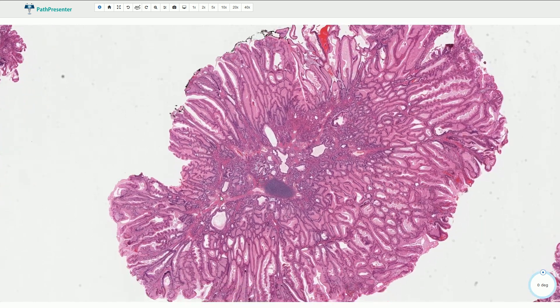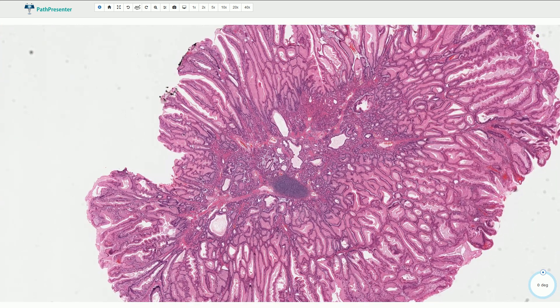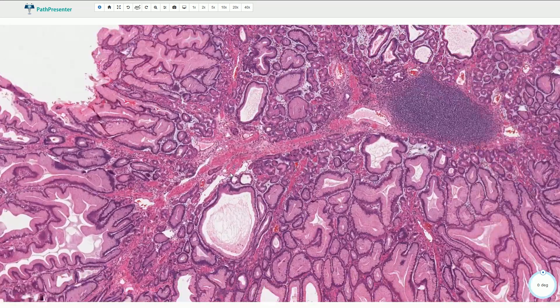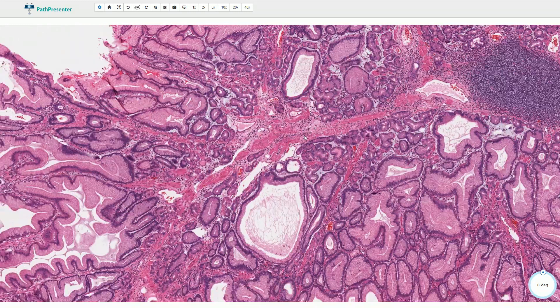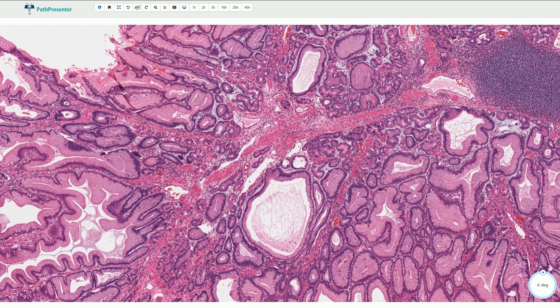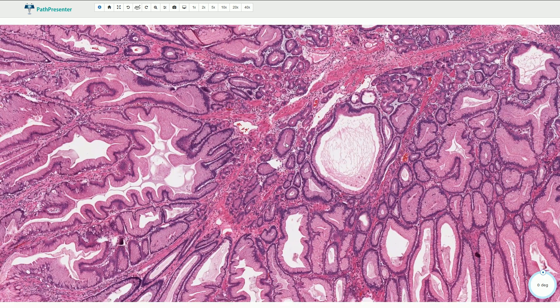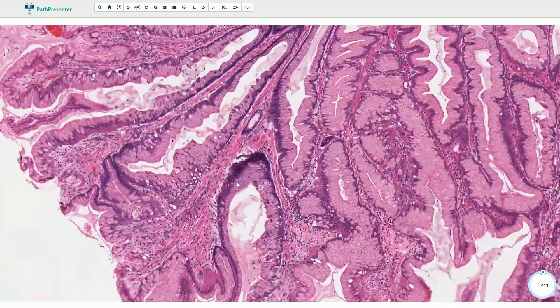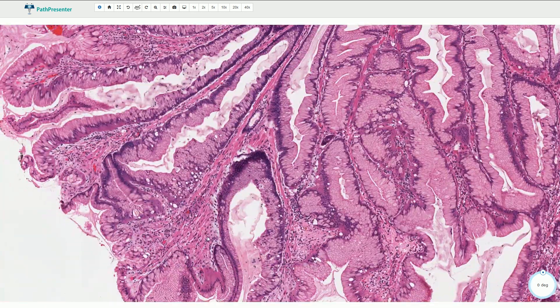The most important histological sign is the presence of thin smooth muscle bundles that create a so-called arborizing pattern. It is not very well visible in H&E stain, but if we go closer we can see these thin smooth muscle bundles that go from the center of the lesion all the way to the surface, and we can still find them here, and they are interconnected.